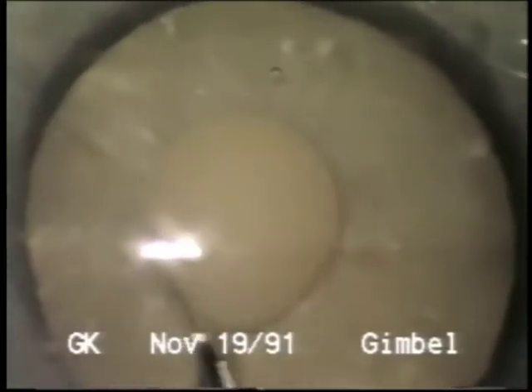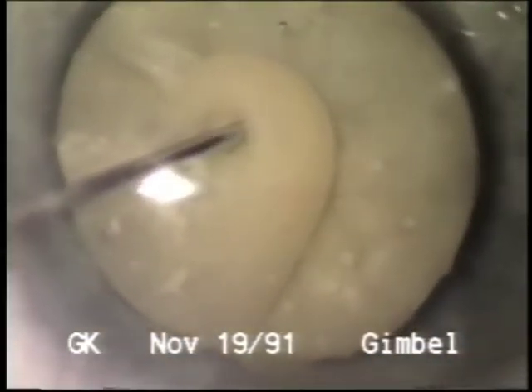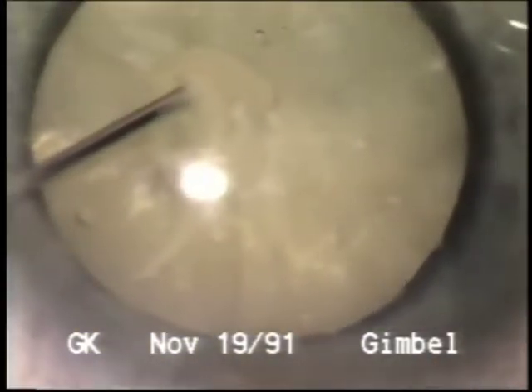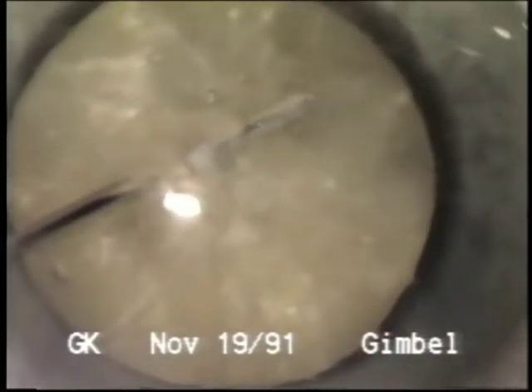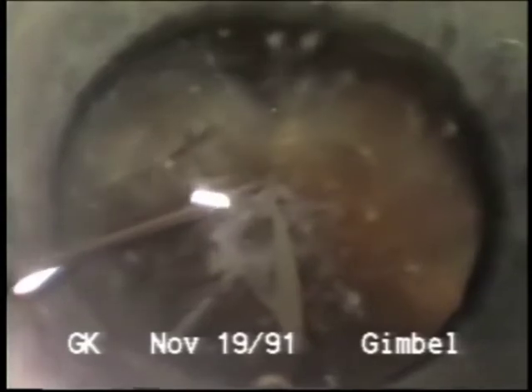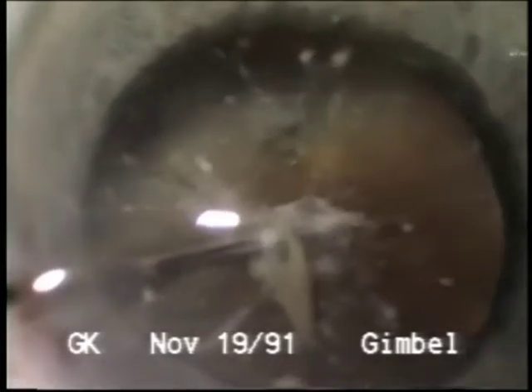This is a Morgagnian cataract with very liquid cortex. I've stopped the capsulorhexis and am aspirating the liquid cortex until we have better visualization. On one case a number of years ago, before viscoelastics, I punctured the capsule and there was a volcano of liquid cortex coming out, so I just stopped, put in a cannula, and started aspirating small aliquots. The whole cataract was liquid, and we ended up with an empty bag with a good red reflex to complete the capsulorhexis.